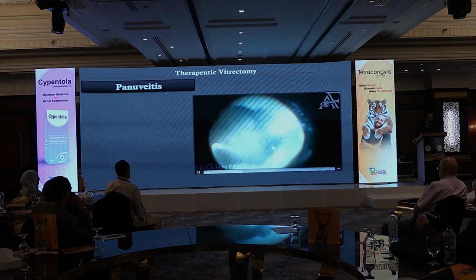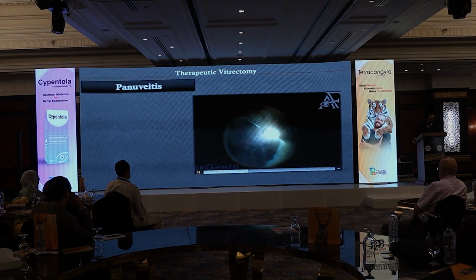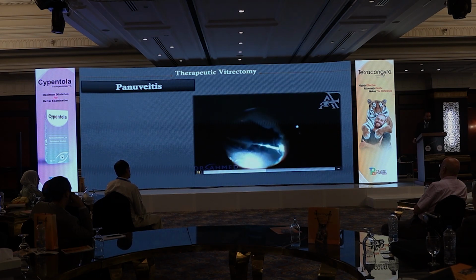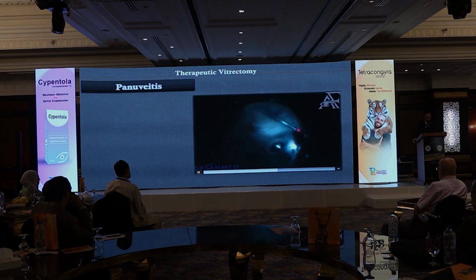But then suddenly, after a while of meticulous core vitrectomy, the disc appeared like a light in a very dark tunnel, which was good. And you can see, of course, the deposits of the infection and the inflammation on the macula. After vitrectomy, this all subsides, by the way, and you have to try your best in these patients. Don't lose hope. Endophthalmitis is not a late stage.